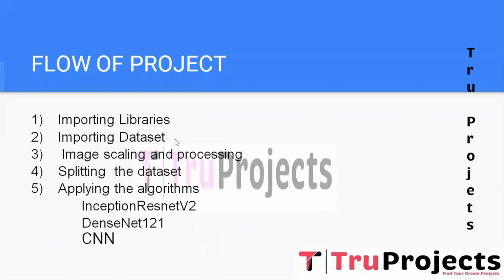The second one is importing the dataset. A collection of retinal images containing both normal and glaucoma cases is acquired and imported. This dataset will be used to train the deep learning model to identify the patterns and features associated with glaucoma. And the third one is image scaling and processing. The imported retinal images undergo pre-processing to ensure that they are standardized and suitable for training. This step includes resizing the images to a consistent size, normalization of the pixel values, and necessary image enhancement techniques.